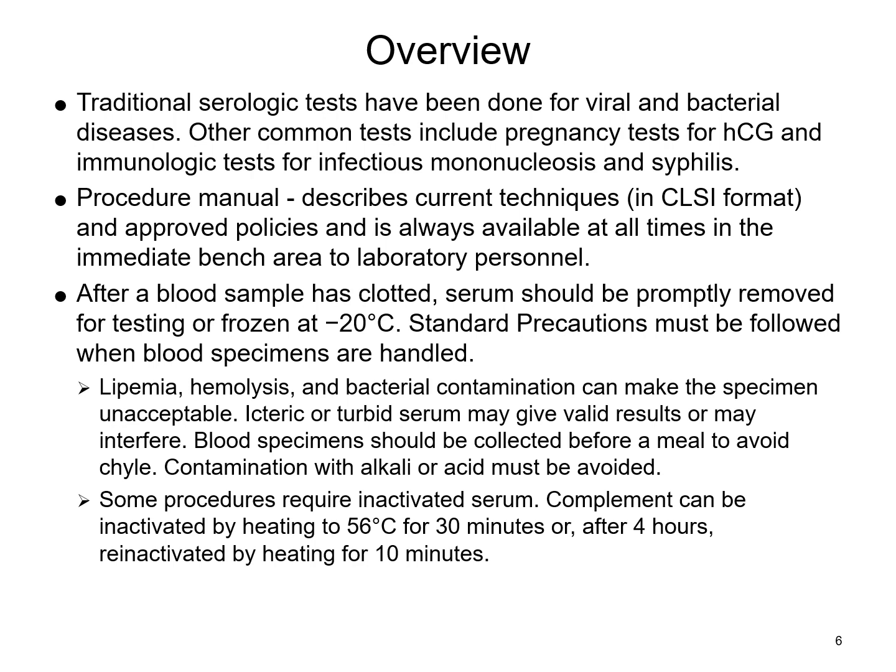So it's going to include things like test preparation, how the facility reports and handles certain things, anything that's interfering, how the test is reported, and safety precautions. There are several different things that must be included. So when you're in the laboratory or at your clinical site, be sure to take a peek at these procedures so you can be familiar with the format and layout, and know where to find information should you ever have a question.